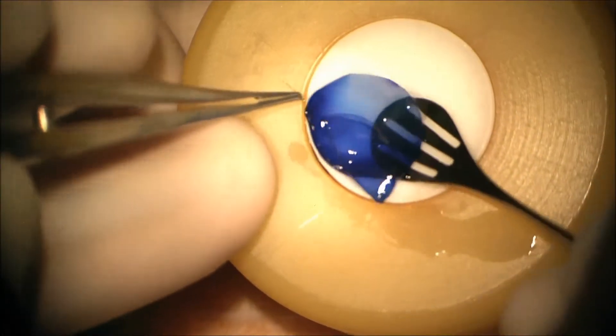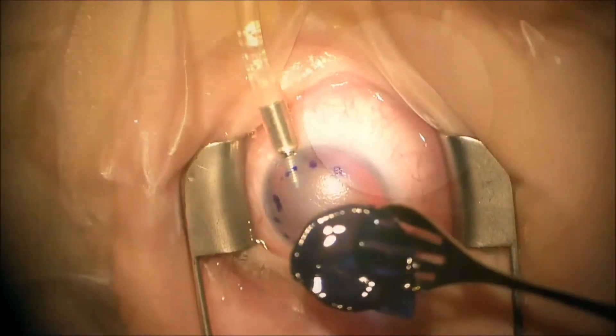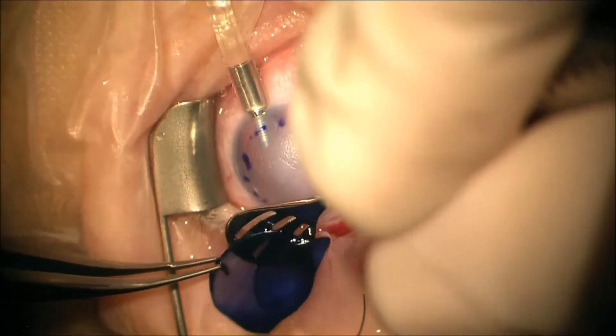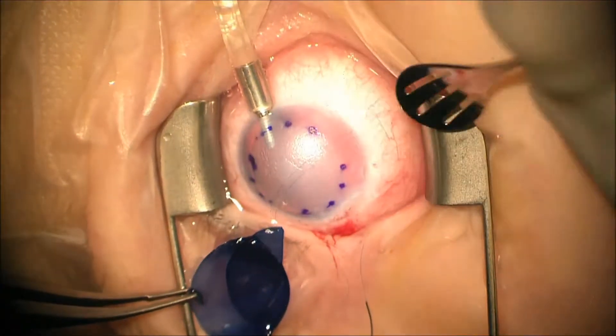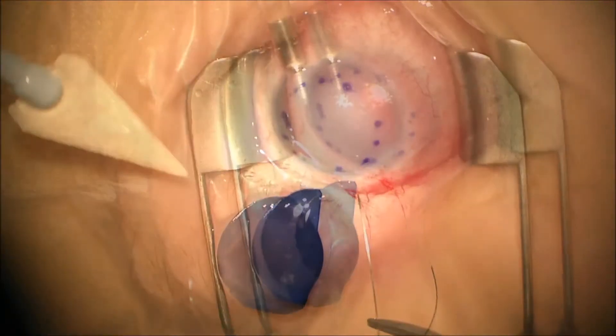Next we take the corneal specimen and transport it into our field. We orient it properly so the sutures are next to the cornea.